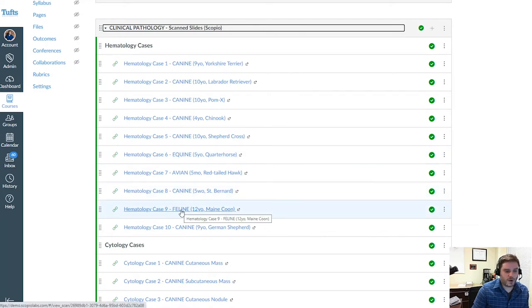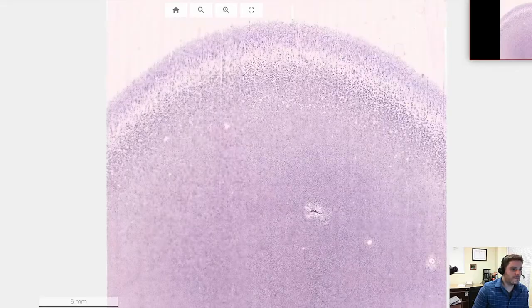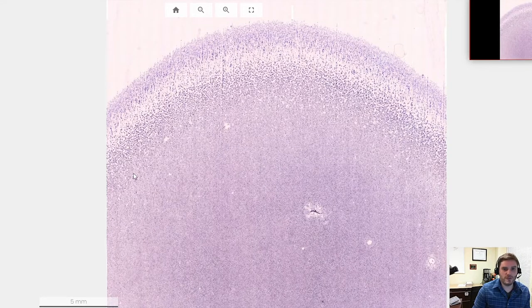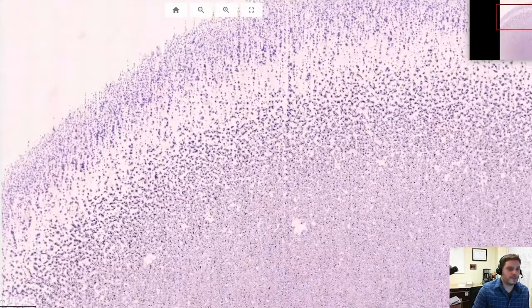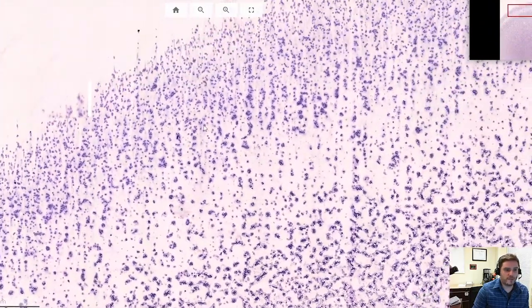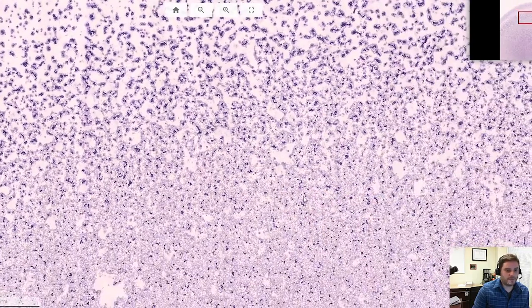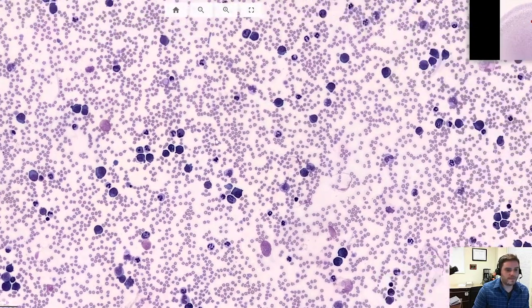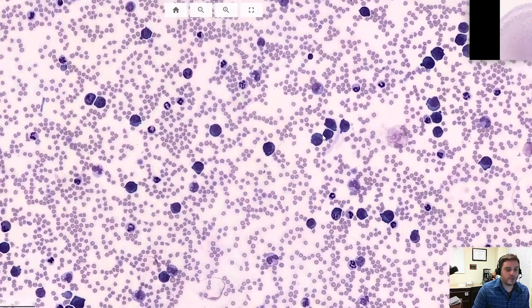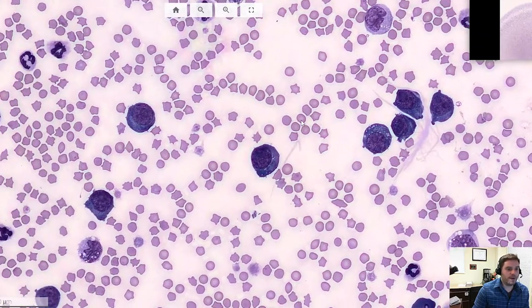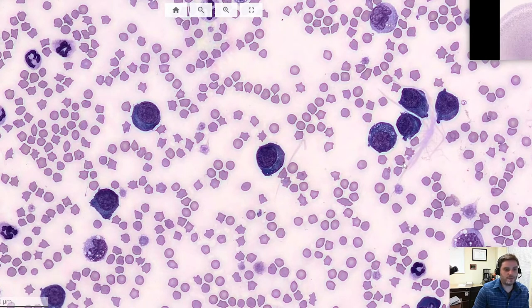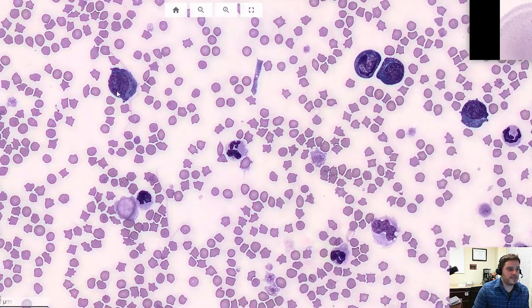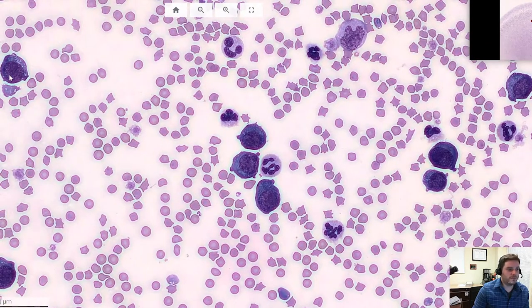For example, let me show you a blood smear from a 12-year-old Maine Coon cat. By clicking on that link, the students have access to the full scanned slide. From low magnification, they can appreciate the feathered edge and the monolayer of the smear. By using their mouse, they can zoom in as they would by changing the objectives on a microscope, and start evaluating the blood smear. They can zoom in to appreciate the predominant cell types, and by appreciating the morphology of these big atypical round cells, the students can diagnose this as a stage 5 lymphoma or lymphoid leukemia in a cat.